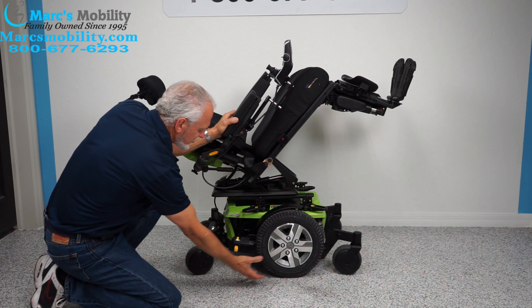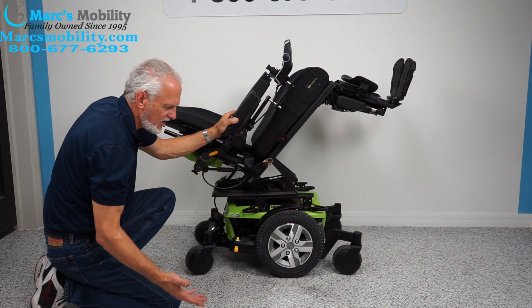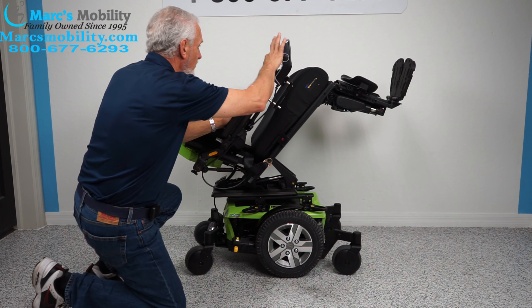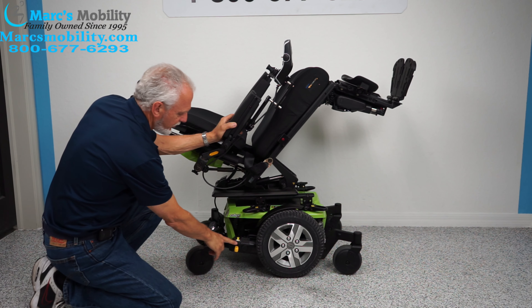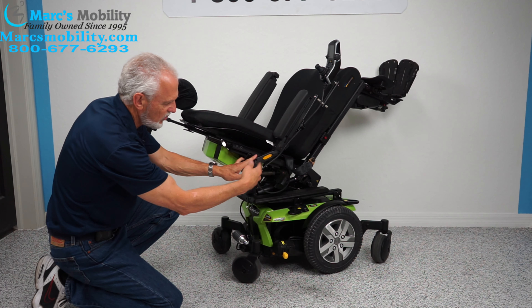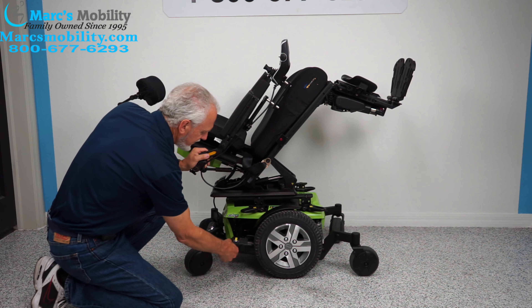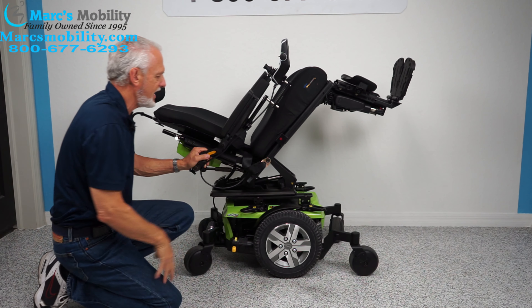You have a motor for each wheel — each wheel has its own motor. Right now you can see it's not going anywhere because it's in gear, plus this chair weighs about 350 pounds. But if you turn the power off and push this lever down, it puts your chair in neutral, so your wheel is freewheeling. You have to do both motors on both sides. When you're done, make sure you always put it back in gear.